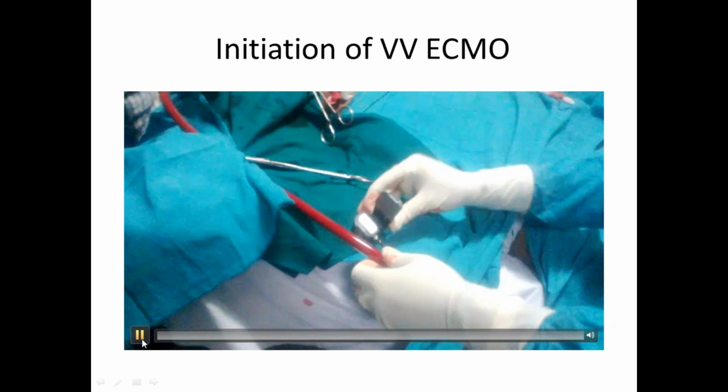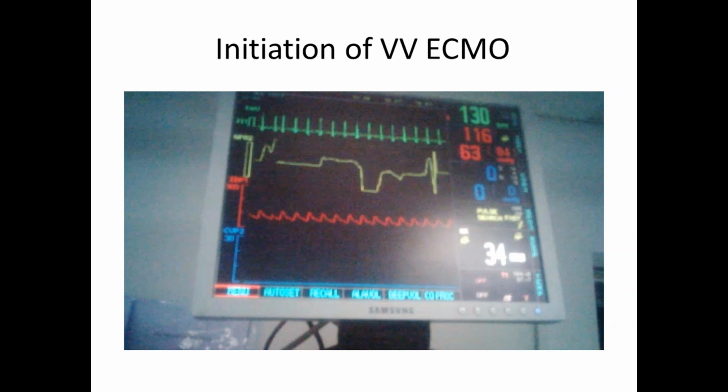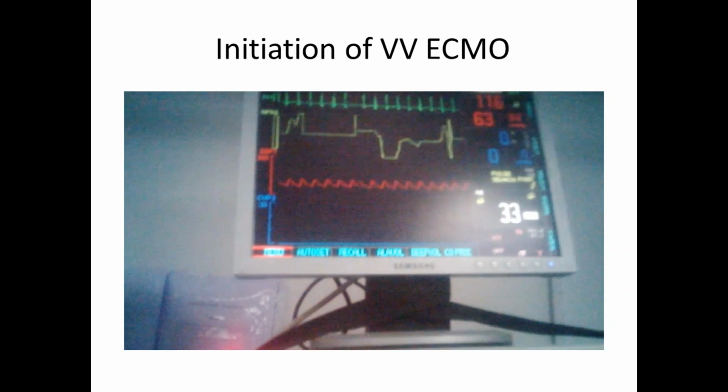See, this is a flow sensing machine. So I put the flow sensor on the arterial side near the cannula. You attach the flow sensor. The RPM is 20. We have still not opened the clamp, so the flow is 0. So the arterial clamp is still on. You increase RPM. This is the patient's pressure. This is the patient's blood pressure.